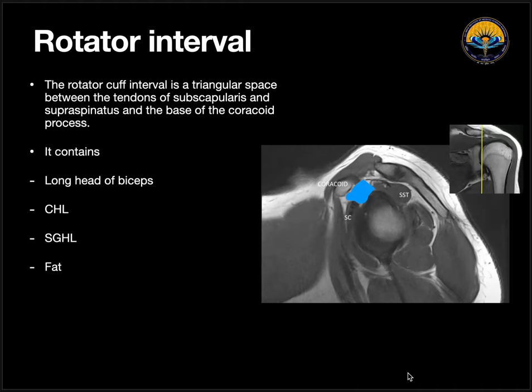Coming to the rotator interval, it is a triangular space between supraspinatus, subscapularis, and the coracoid. This area is the rotator interval. It contains the coracohumeral ligament, the superior glenohumeral ligament, fat, and the long head of the biceps tendon.